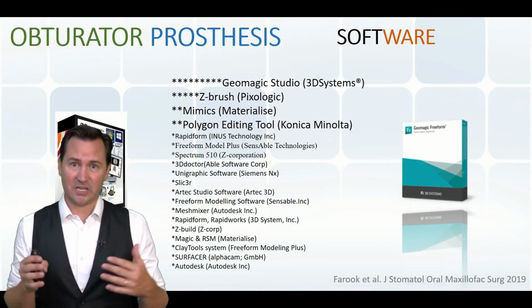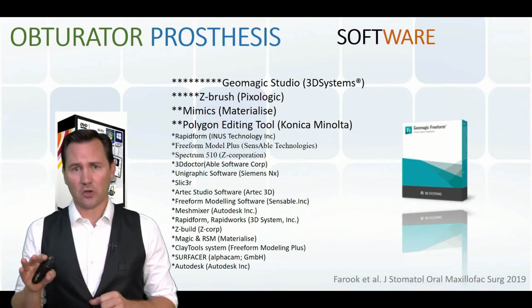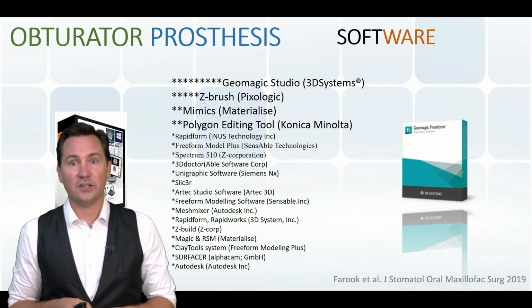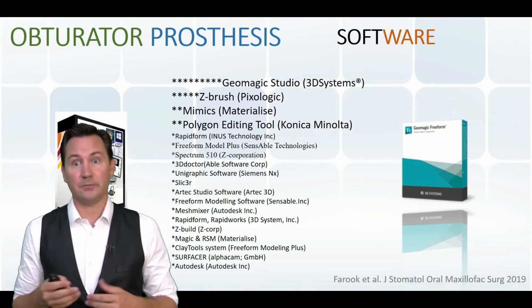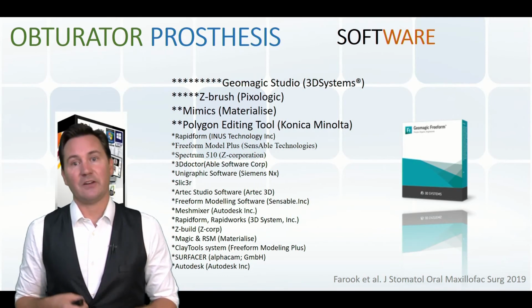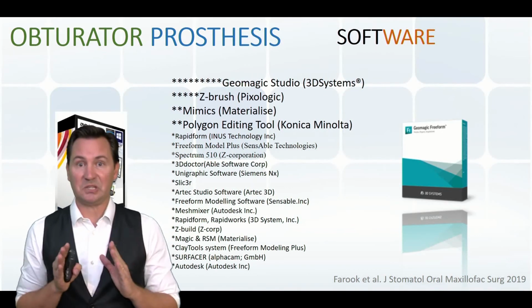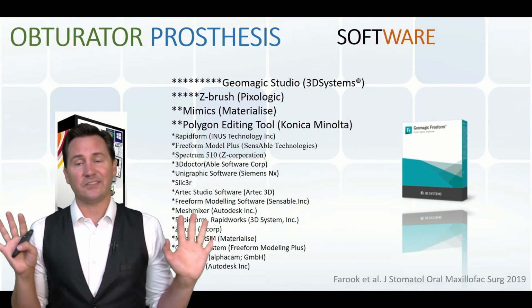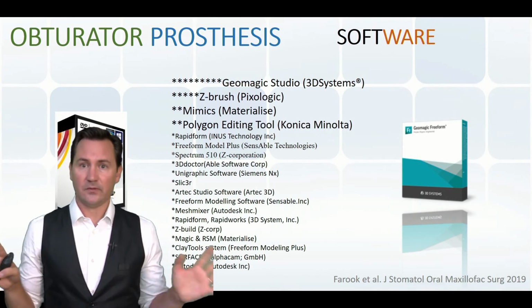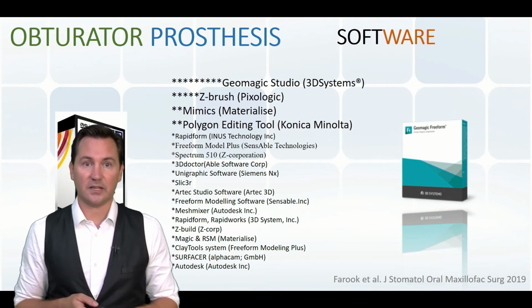Once you have the patient's imaging files, you need to create the 3D file. You can use a lot of software to achieve that. You can see here a non-exhaustive list of software that can be used for maxillofacial prosthetics in the publications. Some are free, some require a license, some are easy to use with very limited options, and some are so comprehensive that you need an IT guy to use them. So there is a wide diversity of software for this step, and we'll see some during applications later.